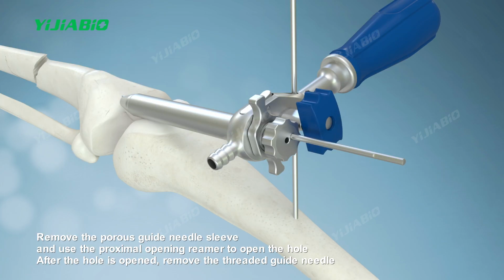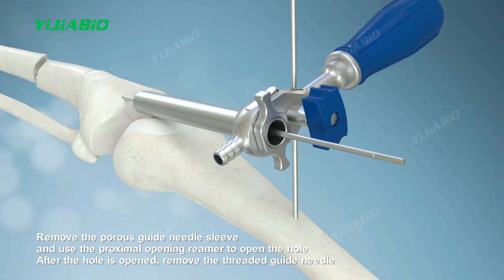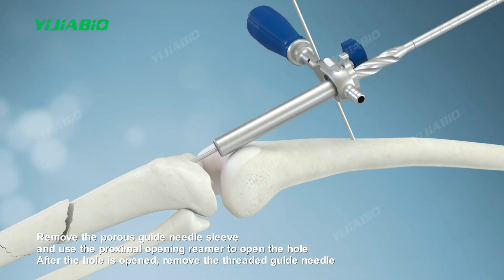Remove the porous guide needle sleeve and use the proximal opening reamer to open the hole. After the hole is opened, remove the threaded guide needle.